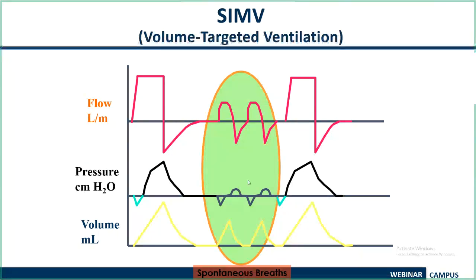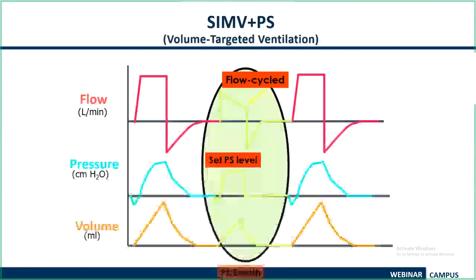Okay, so the muscle exertion will not happen. Whereas in SIMV mode, here the patient will have to exert more. That is why we are not using those modes. So how is this SIMV later changed? The patient triggered breath, you can support it with something called a pressure support. So in SIMV, you have to set the volume, you have to set the minimum rate, and you have to set the support also.